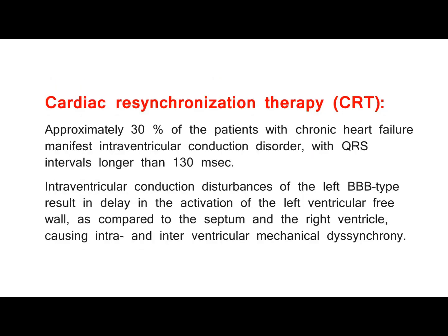Cardiac resynchronization therapy, CRT. Approximately 30% of the patients with chronic heart failure manifest intraventricular conduction disorder, with QRS intervals longer than 130 milliseconds. Intraventricular conduction disturbances of the left BBB type result in delay in the activation of the left ventricular free wall, as compared to the septum and the right ventricle, causing intra- and interventricular mechanical dyssynchrony.